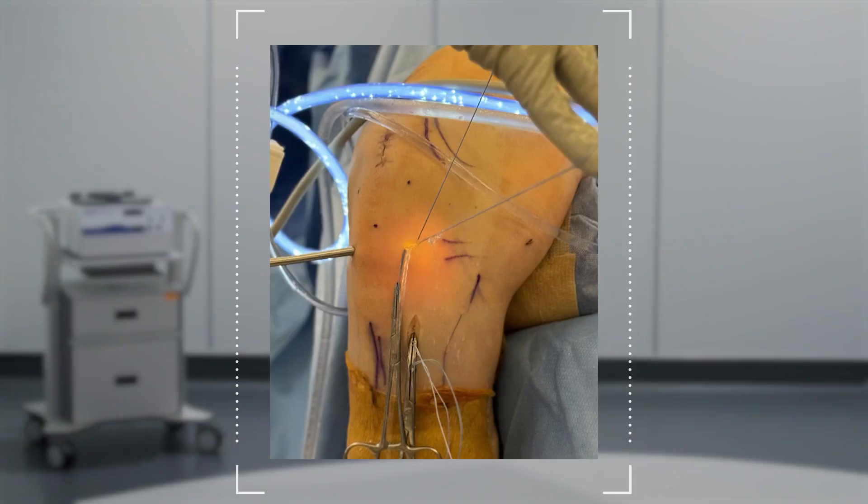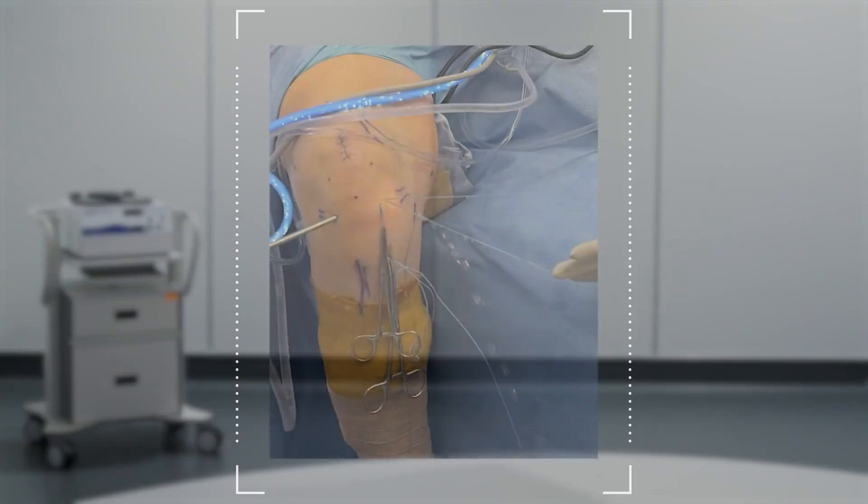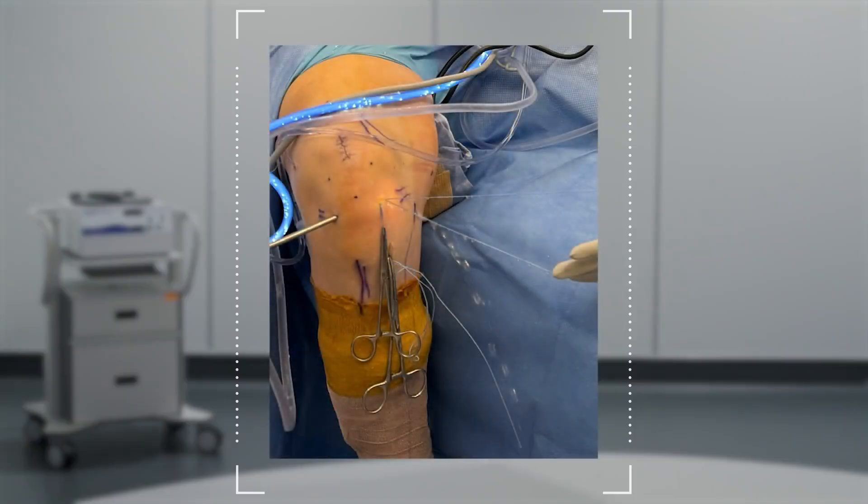The heavier the clamps, the better. This allows for ease of graft passage, but more importantly, also frees up an assistant's hand to do something else to further the case. One clamps both sides of the tibial shuttle stitch — both the AM portal side as well as the tibial incision side. For extra weight, I put an additional clamp on just the suture loop coming into the AM portal to make it even heavier.